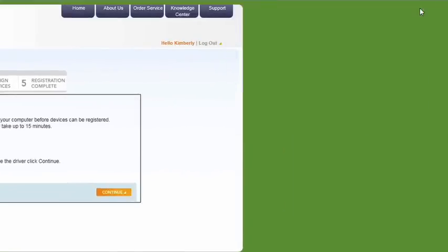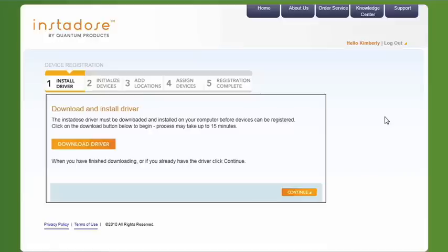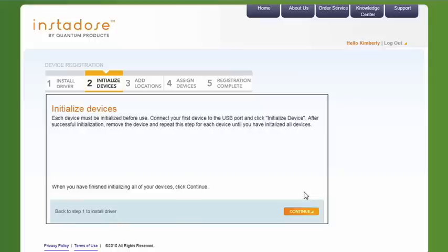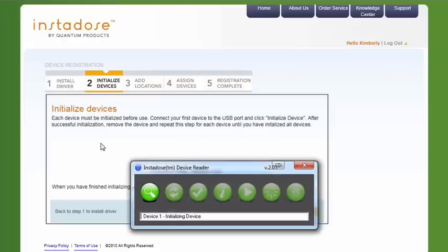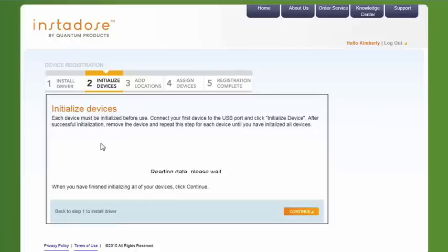Click Continue to proceed to the next step. Next, click Initialize Device. All InstaDose devices must be initialized before use. The initialization process removes any background radiation that the badge may have been exposed to during transit and sets the baseline for future reads.